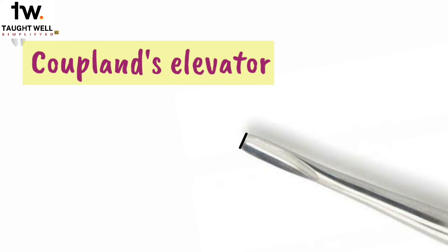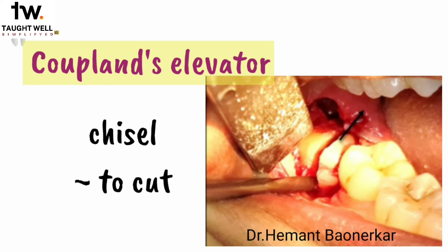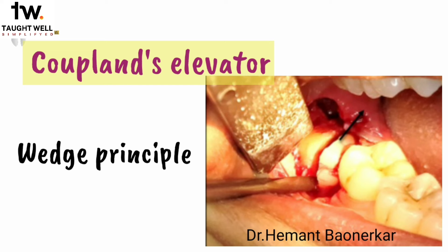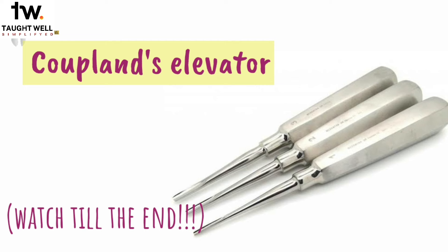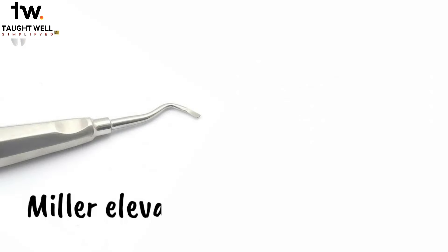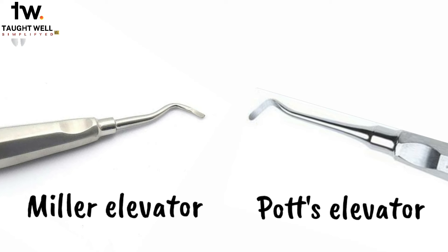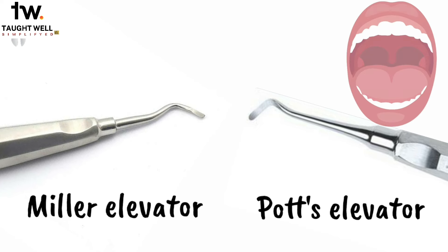This one here is Coupland's elevator. It looks just like a straight elevator, but the working end is sharp and straight cut. For this reason, it's also called Coupland's chisel because it can be used for chiseling the bone to create a purchase point. It can also be used to split a tooth. It is also available in different sizes depending on the width of the blade. Other examples of straight elevators are the Miller elevator and the Potts elevator, but the blade is at an angle from the shank, created so that we can reach more posterior areas of the oral cavity.